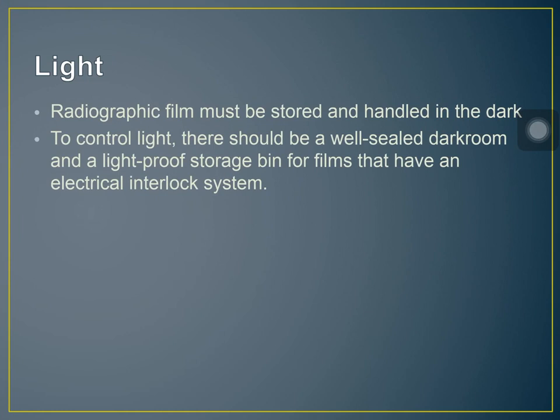Paano po yung pasulyap? For example, nasa developer yung film mo. Meron kang ka-intern or katrabaho na nagbukas ng ilaw, tapos nalaman niya, ay, meron palang dinidevelop, pinatay niya ulit. Pwede magkaroon ng fog doon. Pero, kung pinatitiktikan mo yung film from the developer at may nagbukas ng liwanag, sobrang nakuha niya lahat yung liwanag. Mangyayari doon, magkakaroon ng unwanted density. Ma-overlap niya yung image.